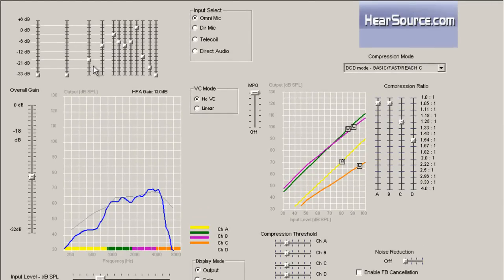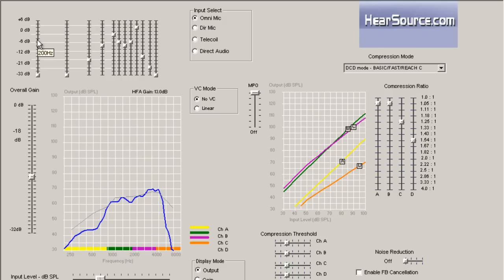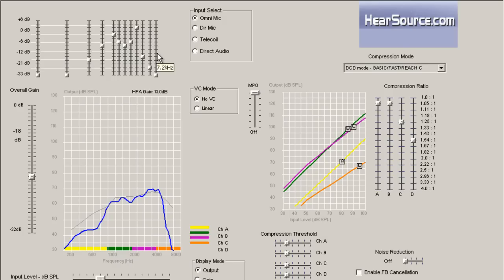Now if I take my mouse and put it over one of these 12 band sliders here, it will flash up the frequency that we're manipulating. So this is 200 Hz, 500 Hz, 1000, and then if we go all the way to the right, your highest frequency is 7.2 kHz.